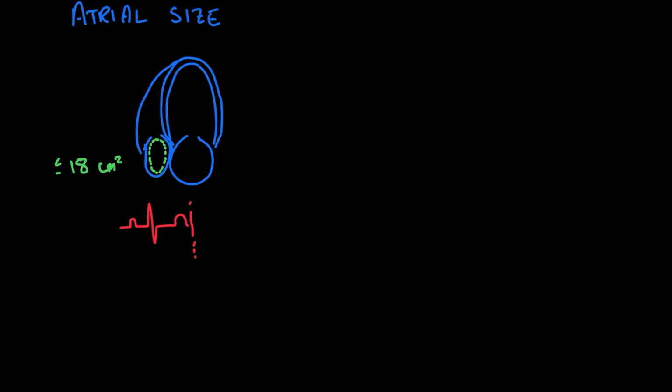Well, for the left atrium, we can also measure the area here in the apical four-chamber. Now we have the benefit of a second view. Let me just shade in the left ventricle here. So if I rotate my probe 60 degrees, what will I get? I'll again see left atrium that is emptying into left ventricle in the apical two-chamber view, and I can take the area of the atrium in this view as well.